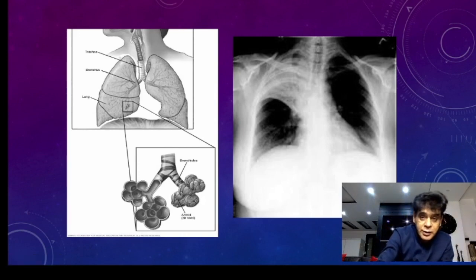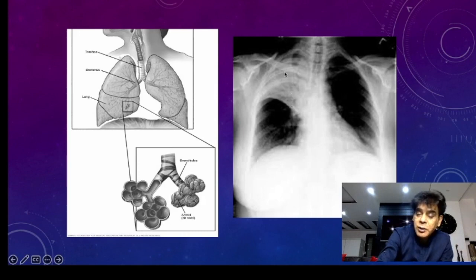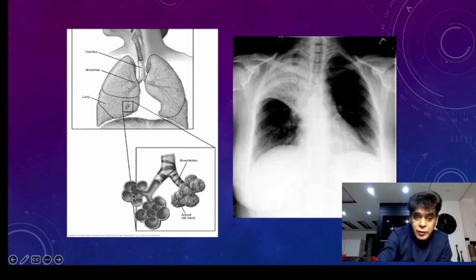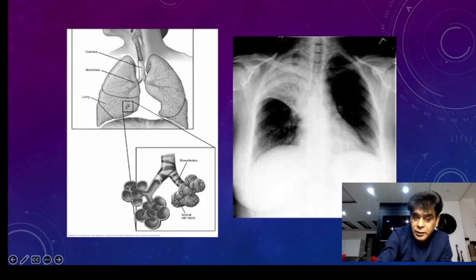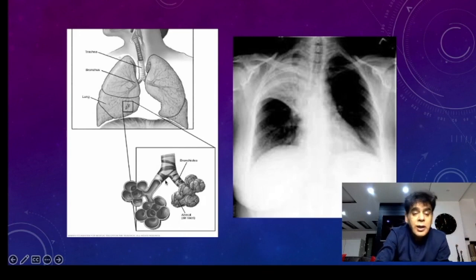Why are we seeing this air bronchogram? Because of the pathology in the alveoli, which is making it bright. The pathology in the alveoli can be in the form of secretions or a mass, which is changing its look from black to white. Or it can be the collapse of the lung.